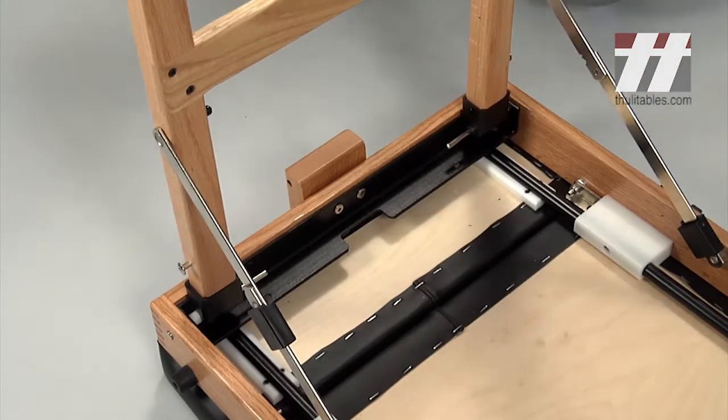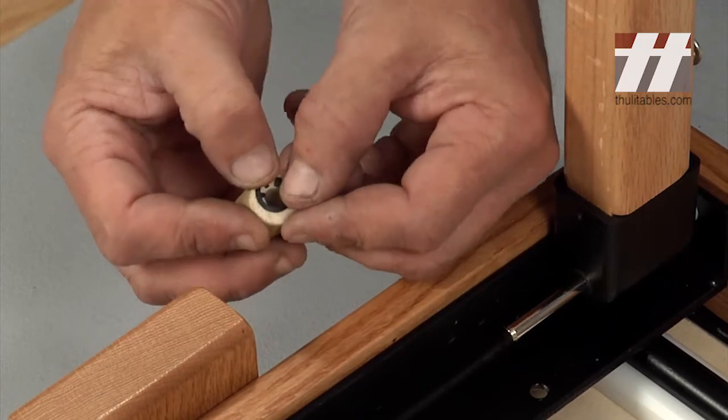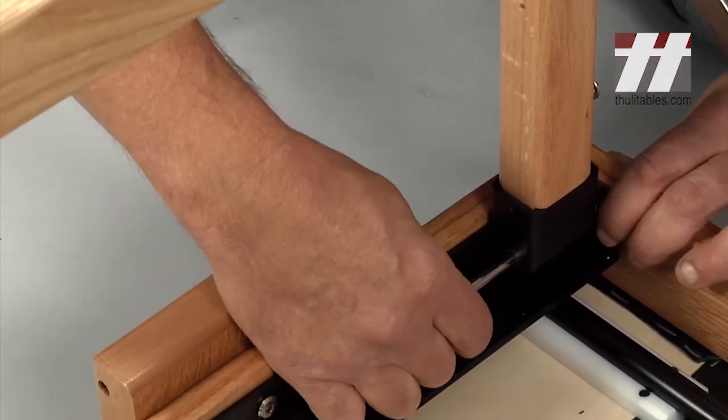Secure the legs into place using the new retaining washers. Use the provided wood dowel to push the washers on. The washers should be aligned with the teeth facing the dowel.